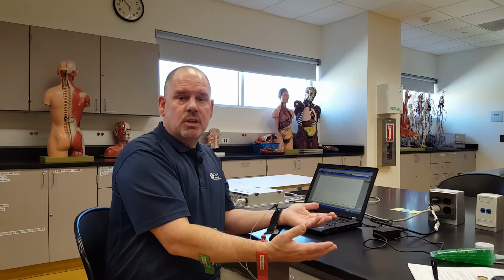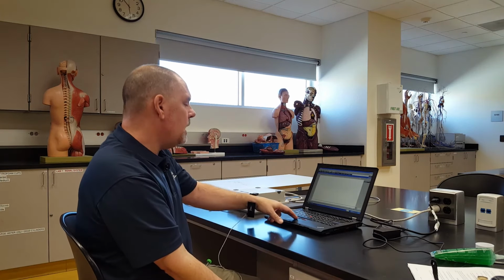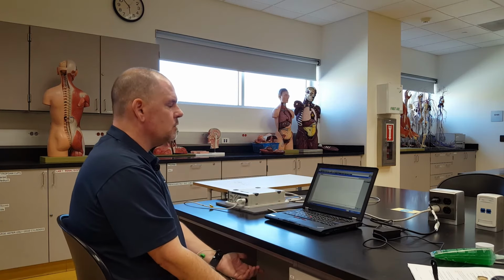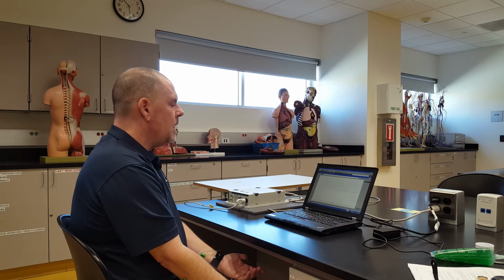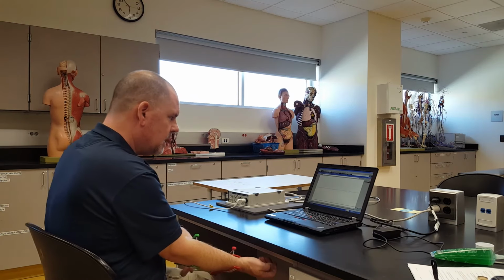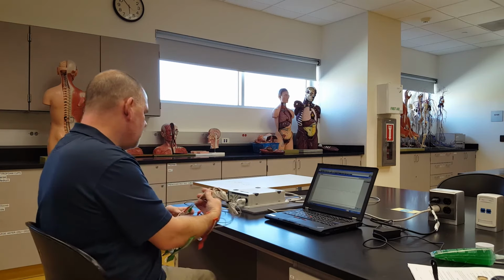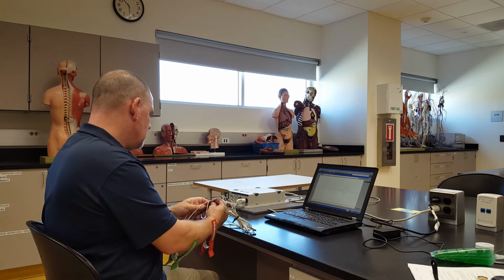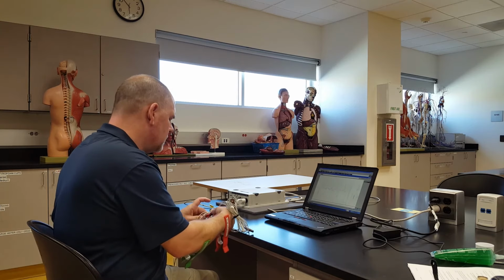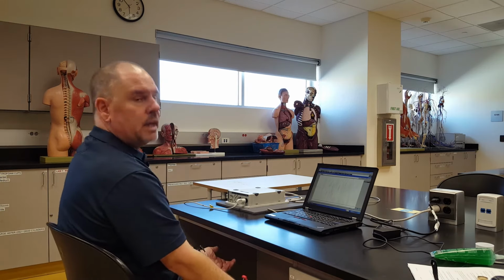And then my job as the patient is really to just sit still and not try to move around very much. So I'm going to go ahead and click the start button here to start producing an electrocardiogram. And I will just sit as calmly as I can and see if we can get a fairly decent trace here. And I notice one of my wires is loose, so let me put it back in. This is what happens in the real world, sometimes you have a loose wire. So now I'll just try to relax and see if we can get a good run.